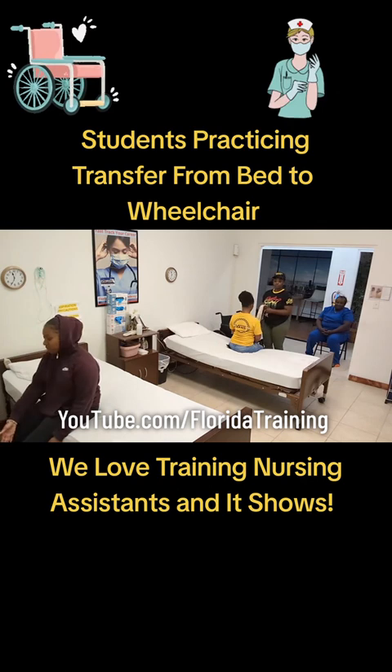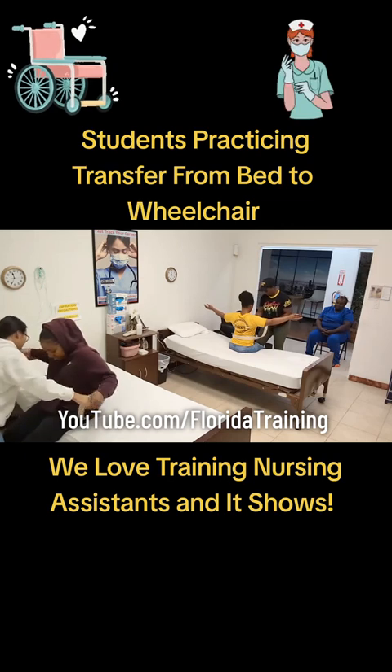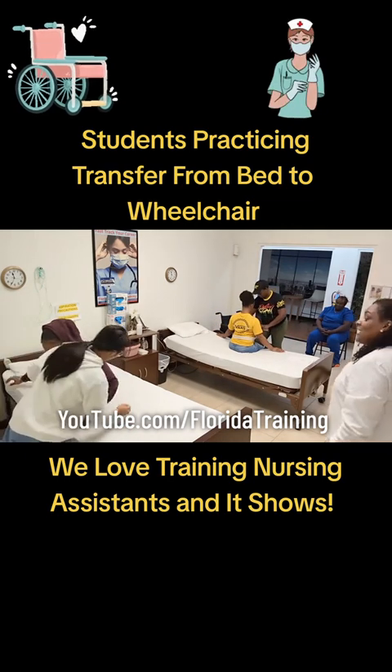I'm worried about her phone. Would you take your phone out of your back pocket? We don't want to call her. So belt first. She's applying the belt right now. You are to apply that belt low and tight. A person who's having the belt applied on them cannot touch the belt. You cannot touch the belt.